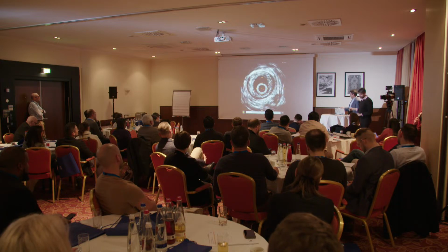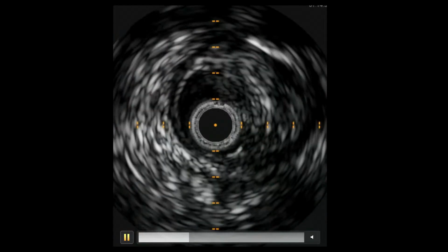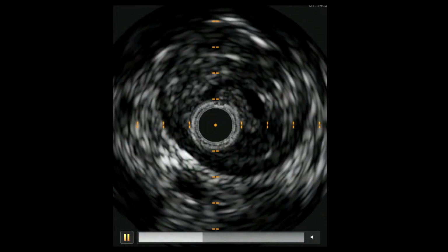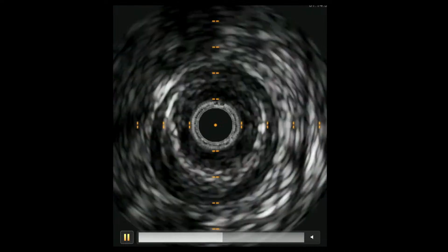So here we're in the lumen. Okay, so black is blood flow. So you can see this is soft plaque in the vessel. But obviously there's always a pullback. Okay, so there's a lesion here. All this is now in CTO. Okay, NT mentioned earlier calcium. So when you see a big white area and black behind it, that's a calcified area.